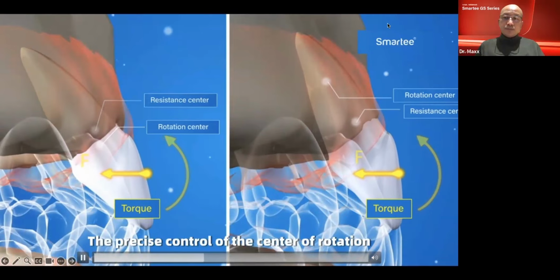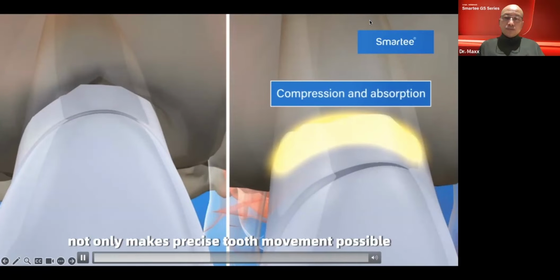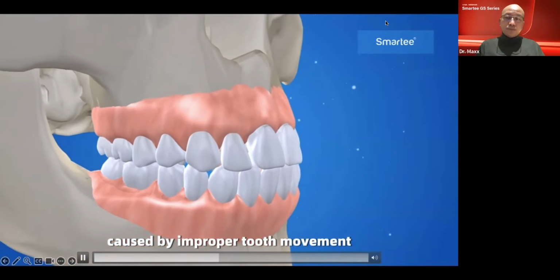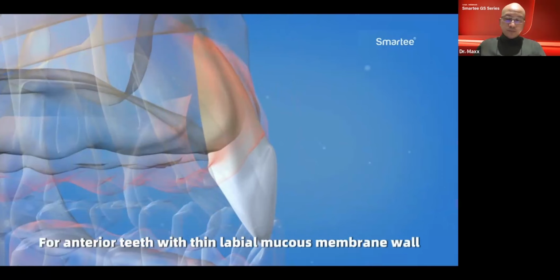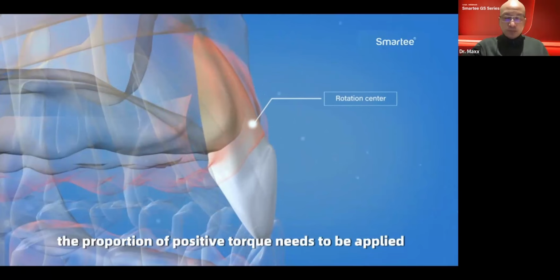The precise control of the center of rotation not only makes precise tooth movement possible, but also avoids bone fenestration and bone dehiscence caused by improper tooth movement, thus achieving the best treatment effect. For anterior teeth with thin labial mucous membrane wall, the proportion of positive torque needs to be applied.